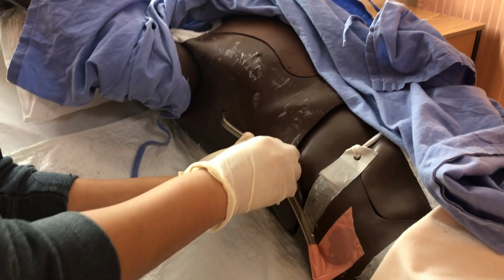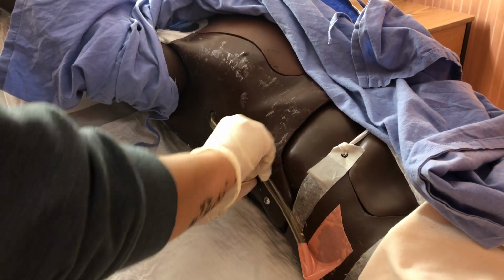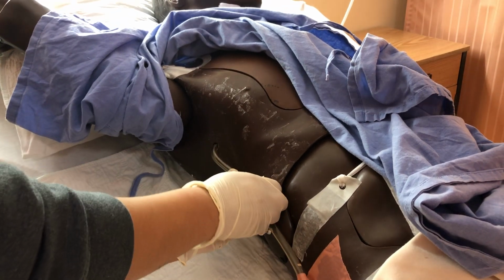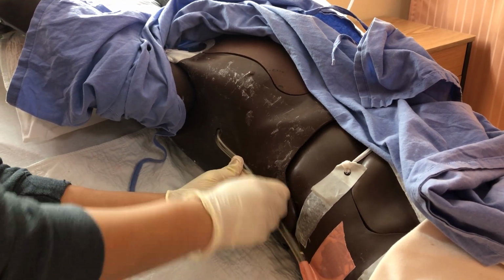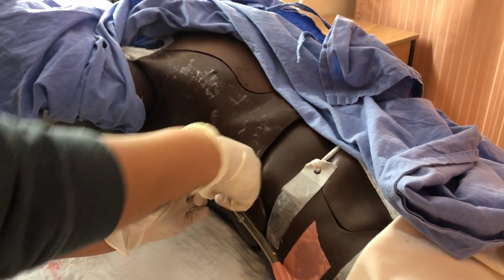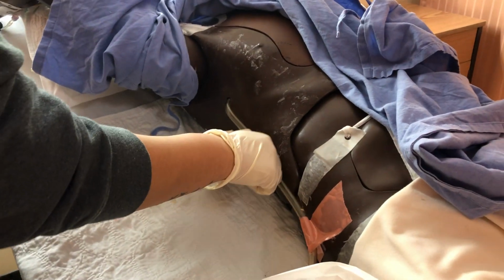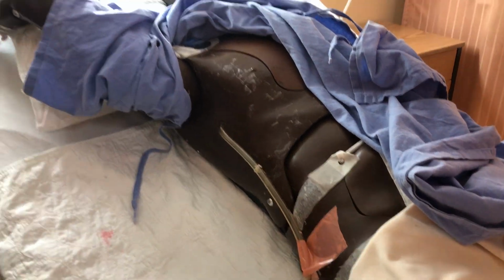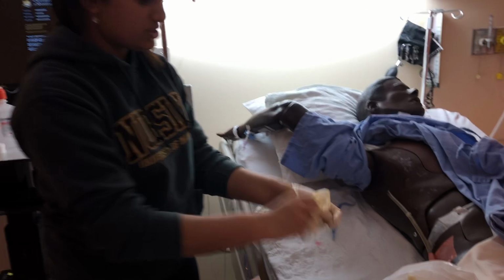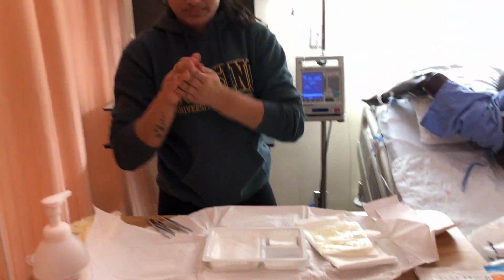And this tube wouldn't be moving as much. And this would be sutured. Right, I got majority of it off. I'm gonna clean it off anyways. So I'm gonna discard these gloves. Perform hand hygiene.